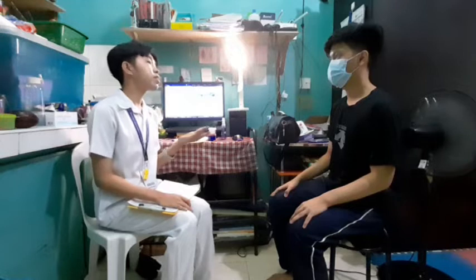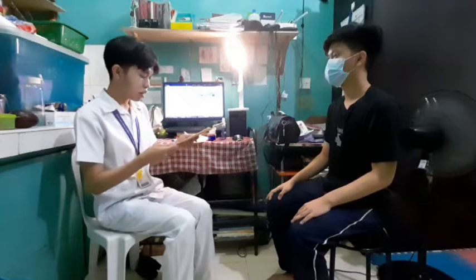Today I will be taking the oral temperature of the client. Prior to any procedure, I must first verify the client's identity, introduce myself, and explain what procedure will be conducted. So — hi, good day, my name is Sunny A. Galaura, your first year nursing student for today. I will be taking your oral temperature. May I know your name? Harvey A. Galaura. Do you have any problems with your throat, head, or opening your jaw and mouth? No. Asking that helps us determine if the patient is suitable for oral temperature. I will now perform hand hygiene to deter any spread of infectious microorganisms.